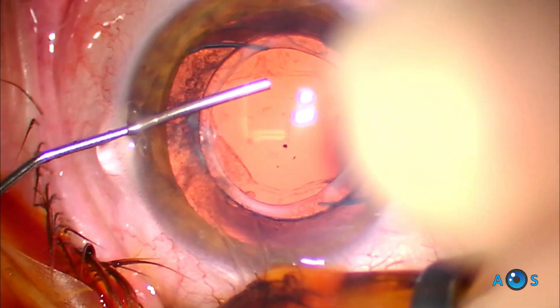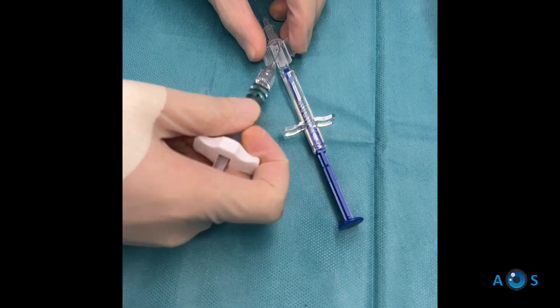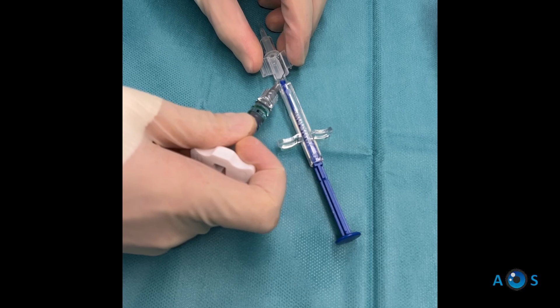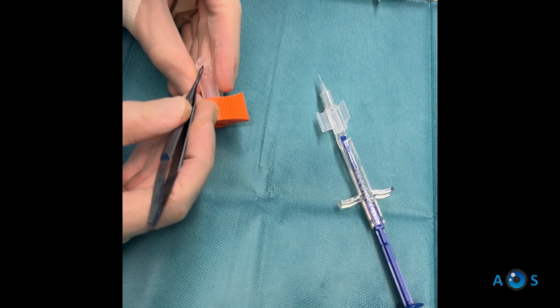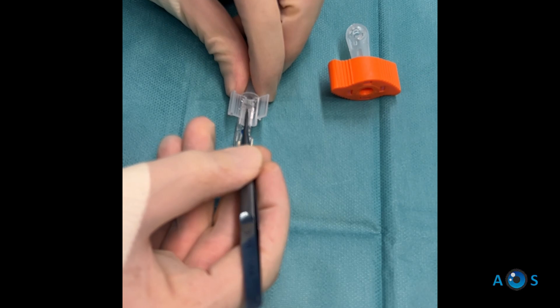After expanding the anterior chamber with OVD, a 2.4 mm incision is made on the steep corneal axis. Preparing the lens is straightforward: OVD is applied in the rails of the cartridge, the lens is grasped with a non-toothed forceps, and carefully placed and tucked in the cartridge, which is then closed.